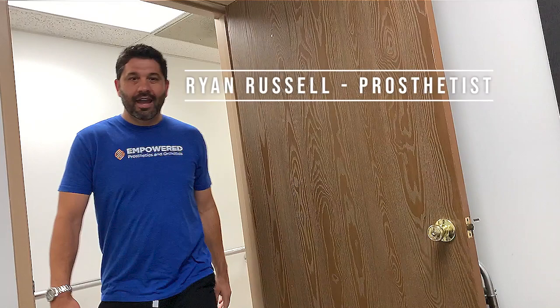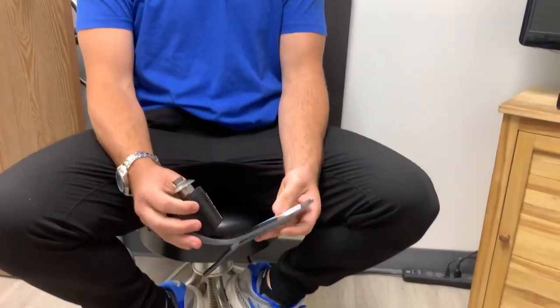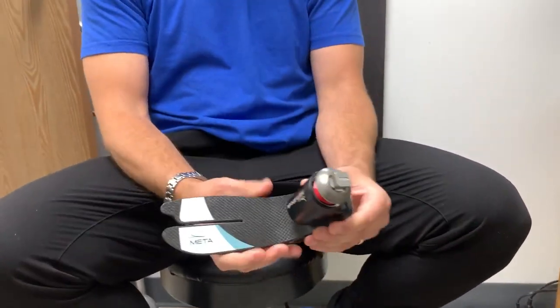Sitting down with Ryan Russell, my prosthetist. This is the Meta Shock — it's Willowwood's newest foot. The shock is built into a unibody design, super low profile. That's always an issue — you can go with low profile feet but then you're missing out on the functionality of a vertical shock, or the leverage of a higher profile foot. But with a lot of patients, we just don't have room.